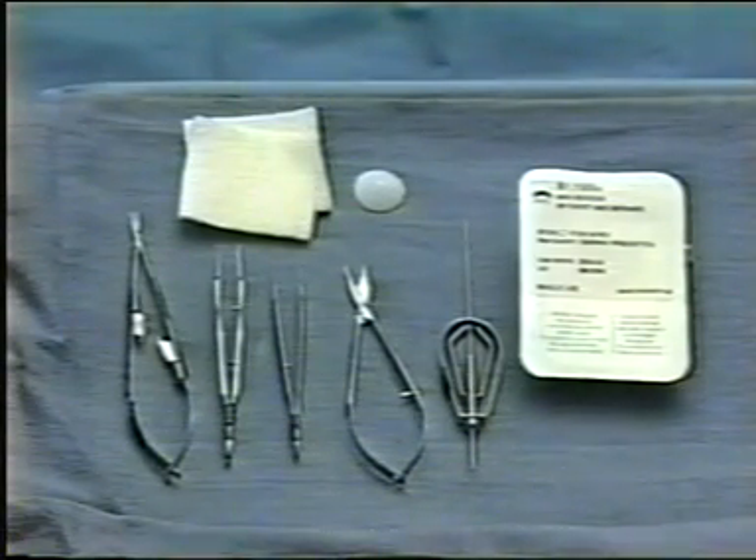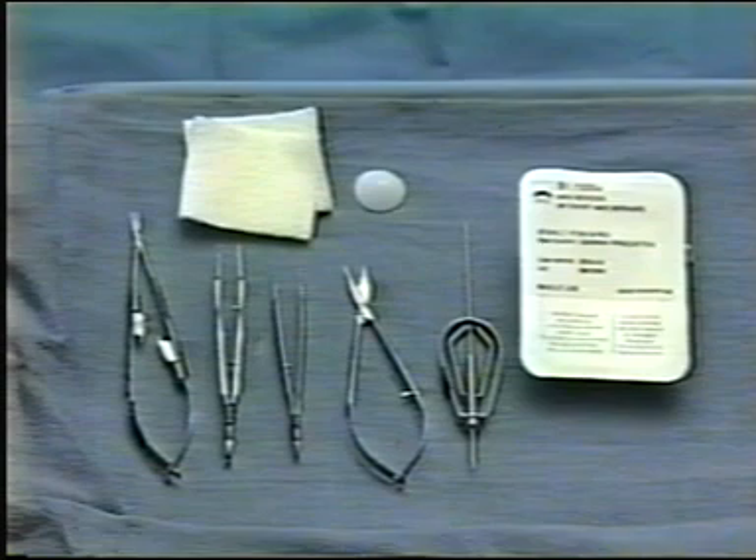In this video, we will show you how to repair a canalicular laceration using a monocanalicular silicone intubation system. It is done under local infiltration anesthesia in the office or emergency department. The equipment needed is a basic ophthalmic plastic suture set.